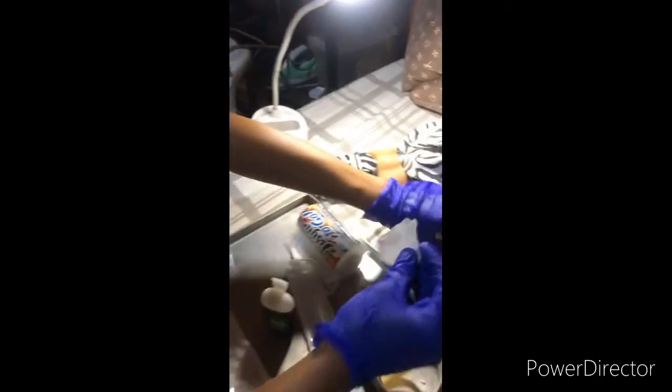Be sure there are no obstructions or kinks in tubing. Place excess coil of tubing on bed and fasten it to bottom sheet with clip from drainage set or with a rubber band and safety pin. Patent tubing allows free drainage of urine by gravity and prevents backflow of urine into bladder. Assist client to a comfortable position. Client's comfort and security are maintained.